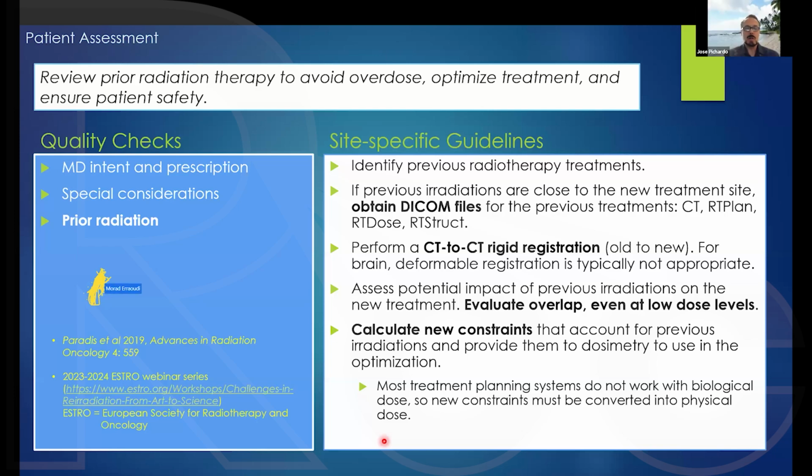I believe so. I believe there are some publications on how to do that. And of course, you would have to treat that case as a re-radiation case, following the process that I've just pointed out in this paper by Paradis and others, 2019. And I agree. The early clinical trials for SRS to brain metastasis was the addition of SRS after whole brain RT. So that guidance is out there.